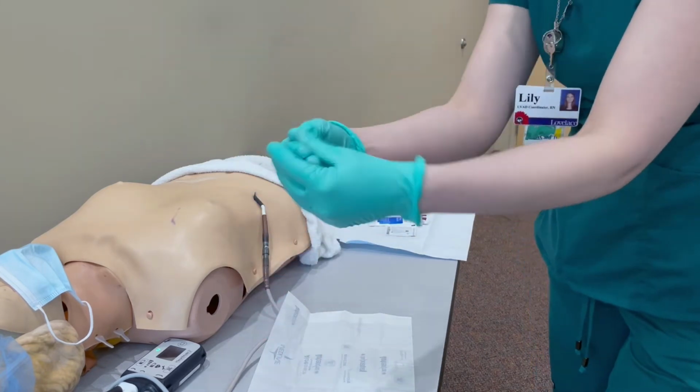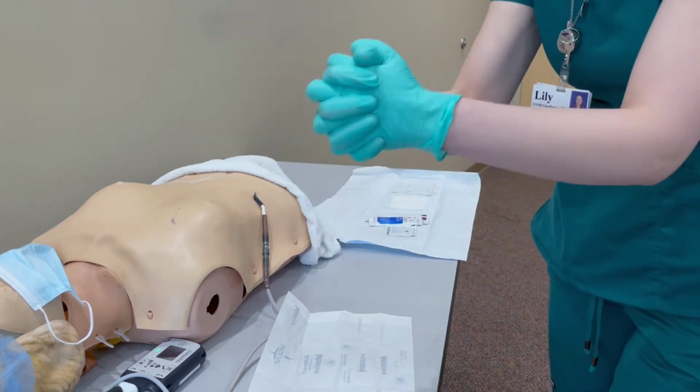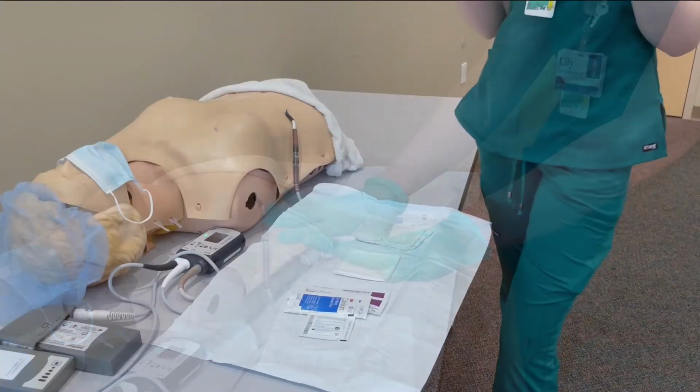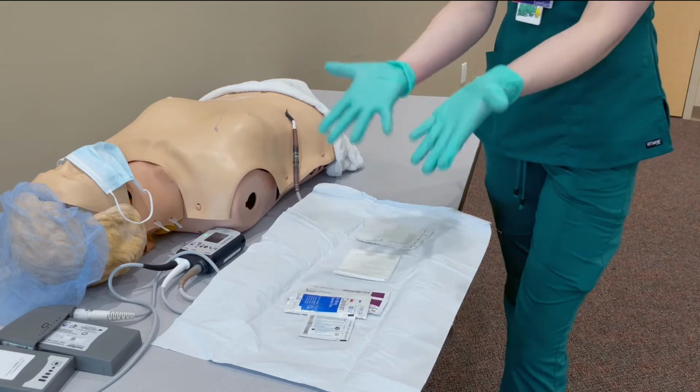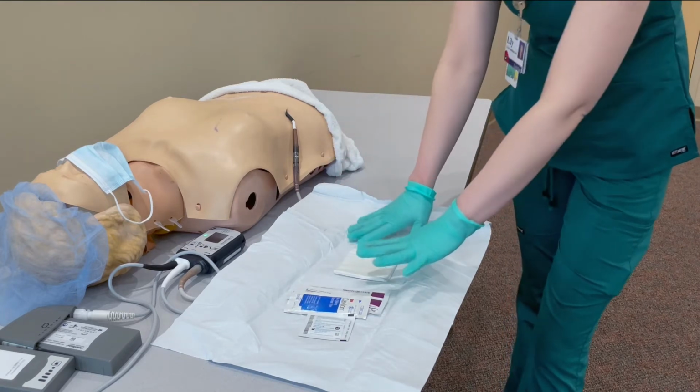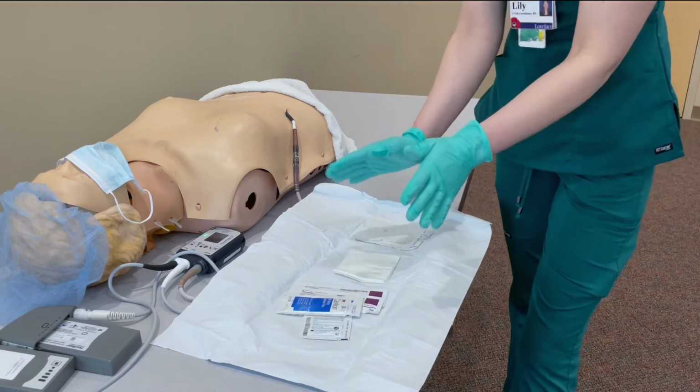Now, if I had messed up fingers, I could touch both gloves and get them nice and fixed. Now you have your sterile gloves applied. Now we have our sterile kit open. We have our sterile gloves on. Because these are sterile and your kit is sterile, you can now touch the contents within your kit.